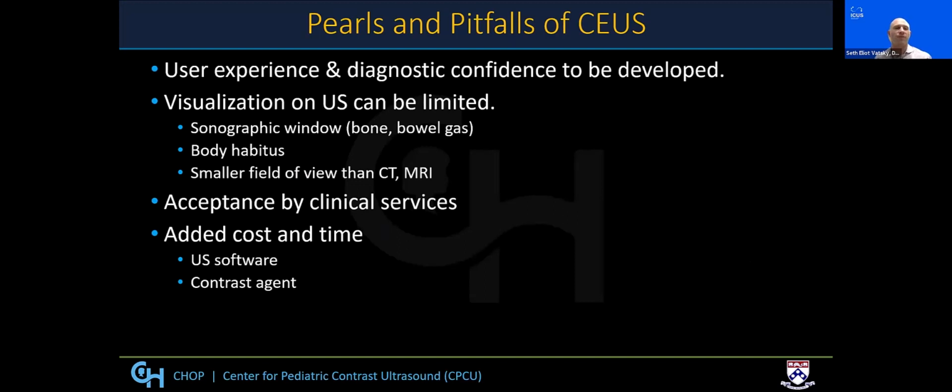So some pearls and pitfalls for contrast-enhanced ultrasound. You need to develop user experience and diagnostic confidence. The visualization on ultrasound can be limited because of sonographic window and body habitus, and you have to recognize that it has a smaller field of view than CT or MRI.